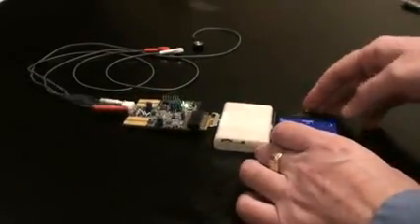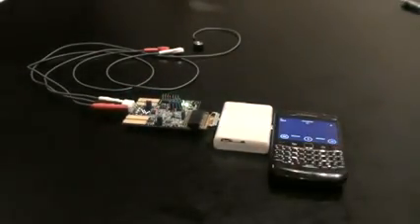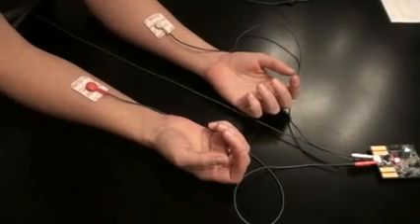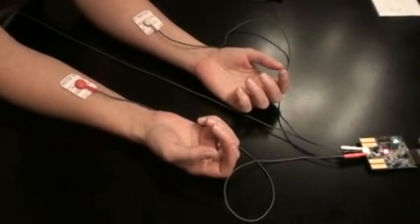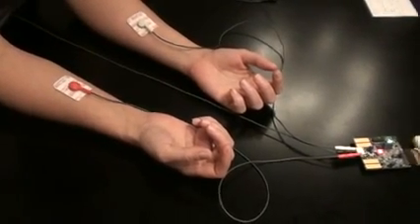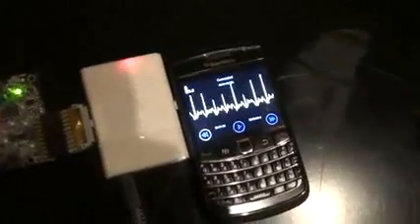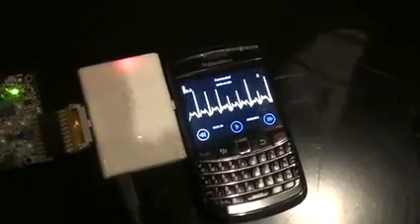Now I'm connecting the leads to the body and running the ECG measurement. Leads are connected to the body and you can see the results on the BlackBerry screen. That data can be sent to your doctor.